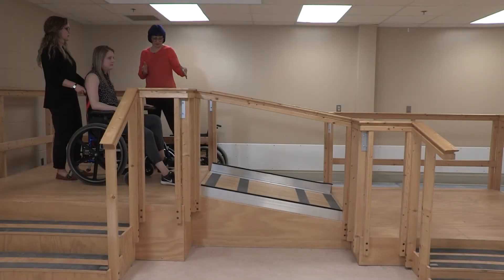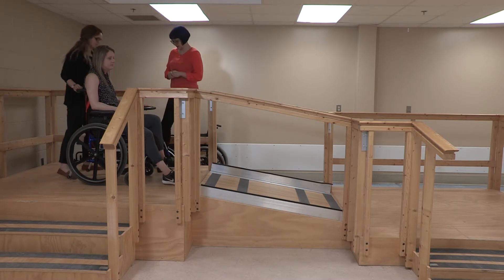Are you able to have her go down this ramp and stop partway, but in a wheelie position? Yeah. Okay. Let's see it. Alright.